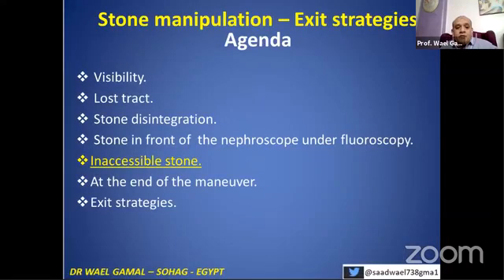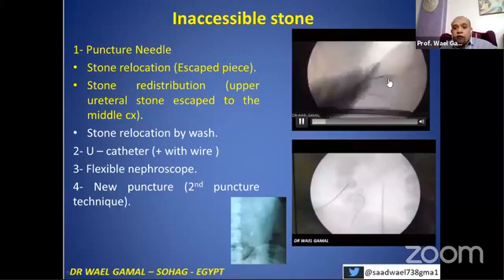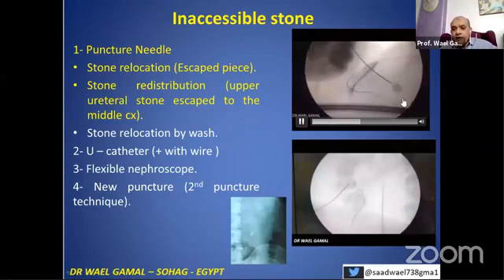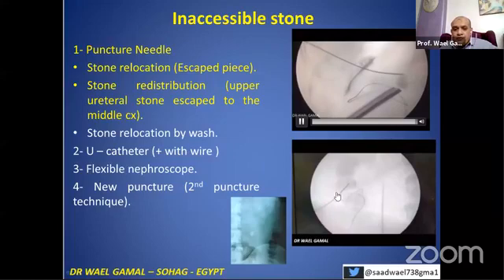Sometimes there is an inaccessible stone. There is a staghorn stone and at the end a piece escapes. You can use your needle to manipulate the stone — to return it to the pelvis, pushing it from outside to be in front of the nephroscope.